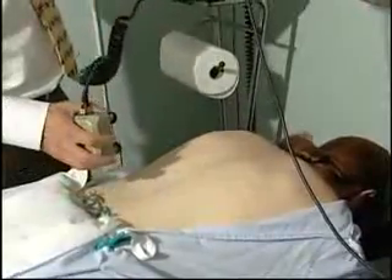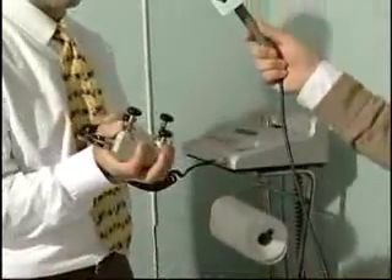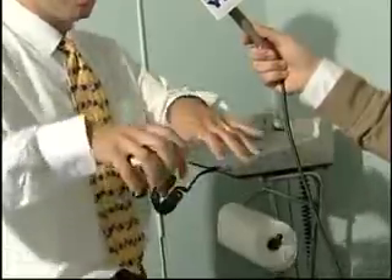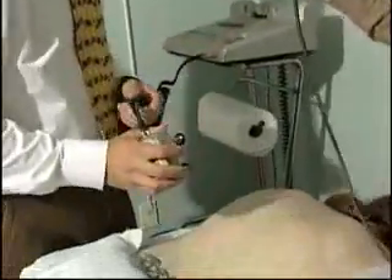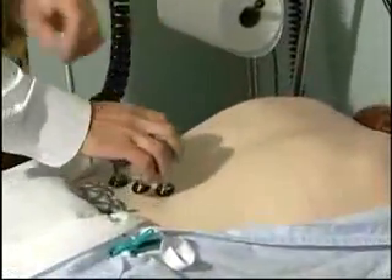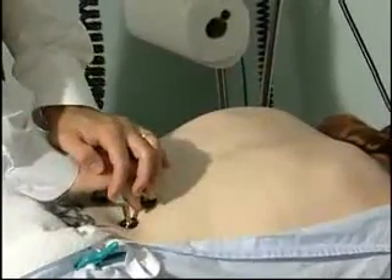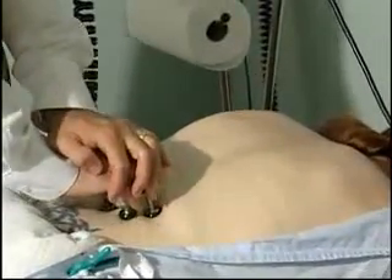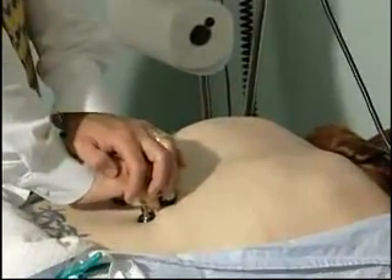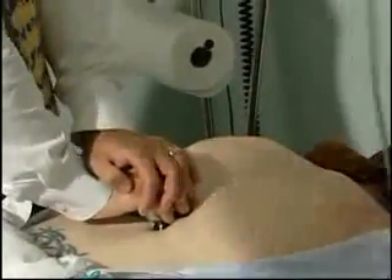Then we get to the mobilization portion. Two prongs activate at a time — it does the first two, then the second two — so I'm constantly rotating the spine. It does not hurt most people. Sometimes there's a little tenderness at a specific point, but it's certainly less painful than injections or surgery. Most people are very comfortable and we've had people actually fall asleep on it. I'm moving up and down, going through the whole spine, helping to rotate each vertebra over and over again.